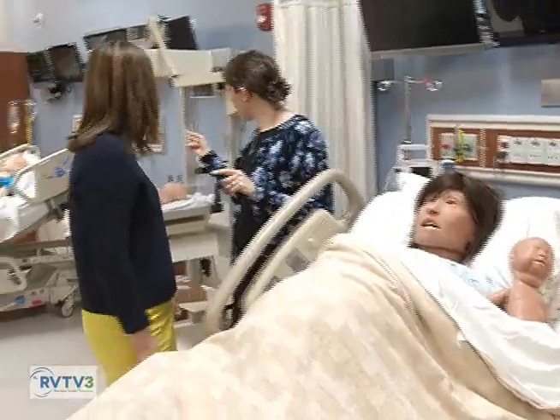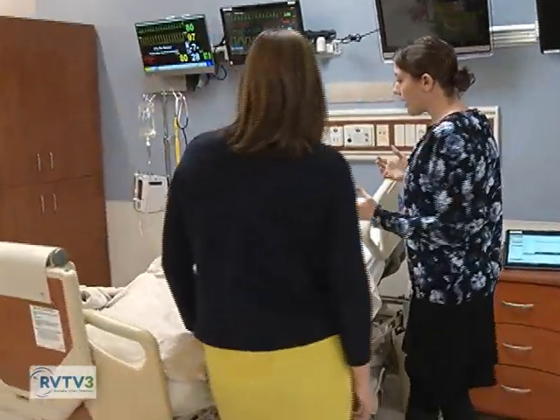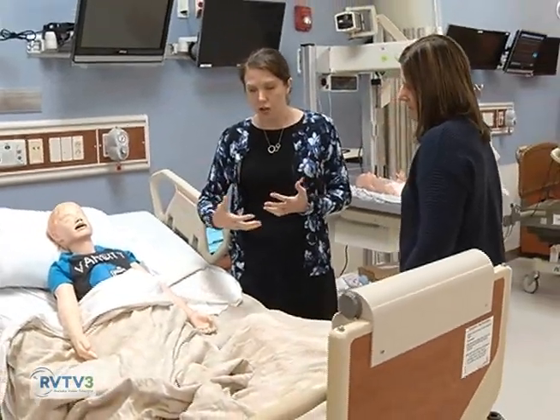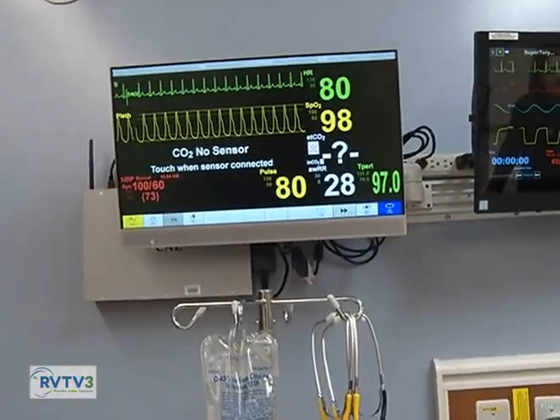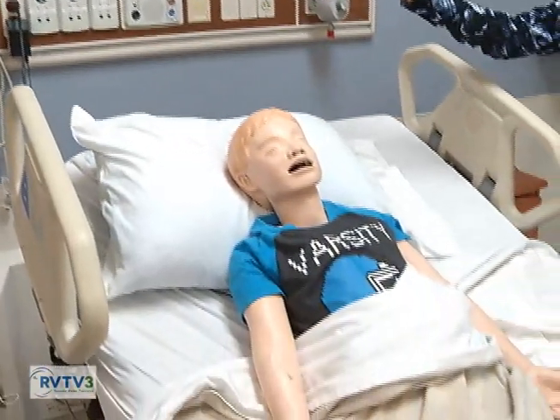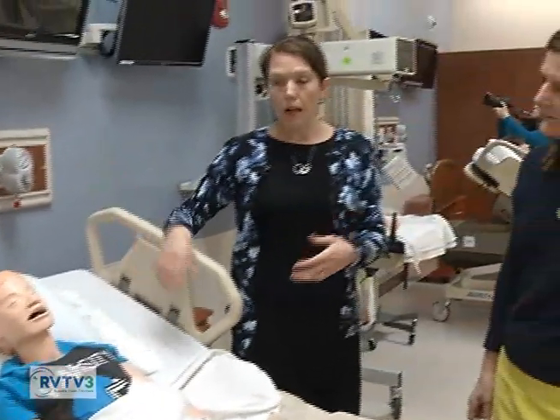And so over here, we have our pediatric mannequin. Again, he can simulate different kinds of physiological issues that are really typical within a pediatric case. Again, up here we have his vitals along the wall. You will see this is exactly like a normal hospital head of the bed would look. And so we are also able to replicate, if they have to give him oxygen, how do you engage in that hookup? How do you actually do that kind of work?